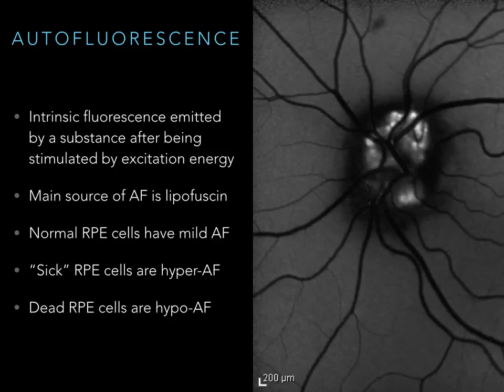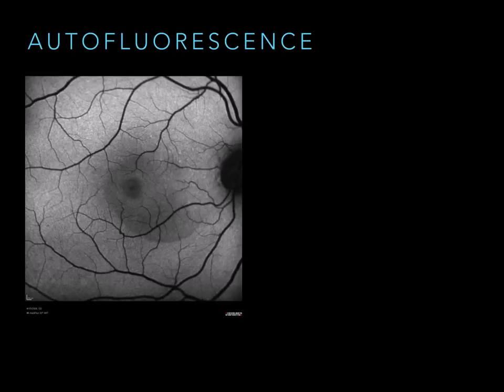I've got drusen up here from a really cool autofluorescent image that I got off of a guy from like Kazakhstan or something. But the thing to remember about these RPE cells is that when you're doing one of these FAs or FAFs, you can prime it a little bit. So if you just shine that blue light in for a few seconds and then take your picture, it's going to be somewhat dim. If you shine that blue light and really torture the patient for a minute, which you probably shouldn't, it's going to be really bright. So there's a lot of variation in terms of the brightness of the image that you get. We need to move along because I only have 9 minutes.